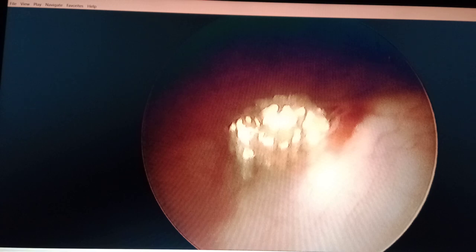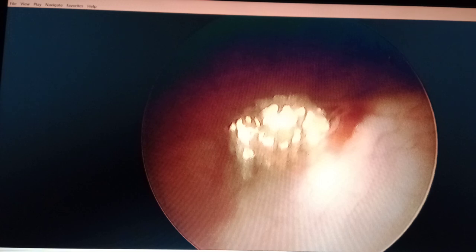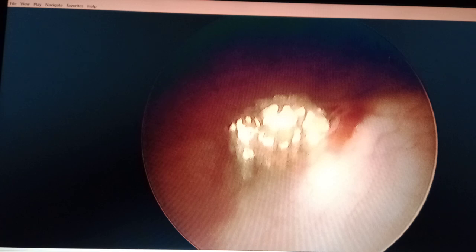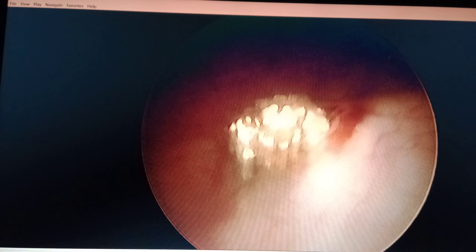So we planned for cystourethroscopy followed by left-sided ureterorenoscopy and left DJ stenting — double J stenting — after clearance of the stone. Let's now go through the operative findings of this patient. You must have discussed many histories and examination findings regarding renal stone disease, ureteric stones, and bladder stones. Now we would like to show what it actually looks like.